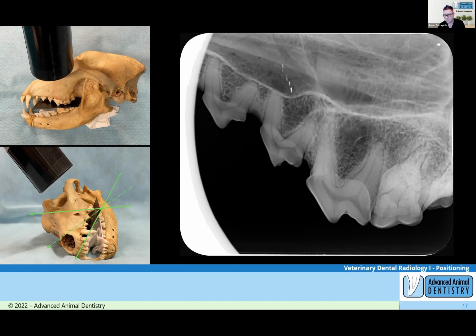Your plate and your machine are different to the next door's, so you have to work with yours. Everyone else's numbers are a good starting point for sure, and you don't have to manipulate them much. It's nothing like the rest of the body. When I'm doing them, I'll go anywhere from 0.2, 0.25 for a cat up to 0.5, and sometimes 0.6 for a staffy mandible, because they're so thick and dense to get through.